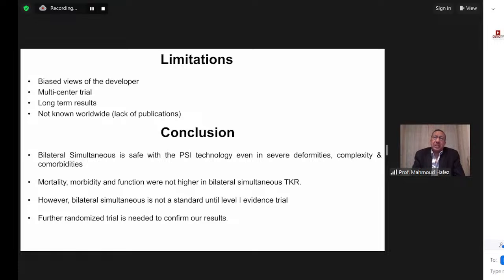We developed this technique and we use it in what we call a hospital-based fashion. This technology is based in the hospital, where we manufacture everything locally, at a low cost and in a very short time, up to 2 days. We also do it for all implants, using a CT scan, and for very complex cases, as opposed to the PSI by implant companies, where they insist that you do it for straightforward cases.